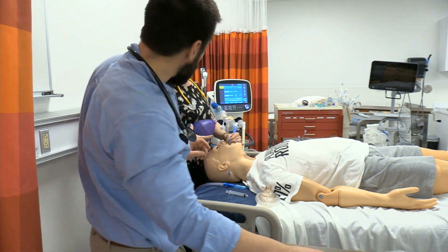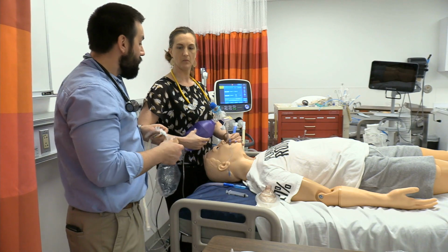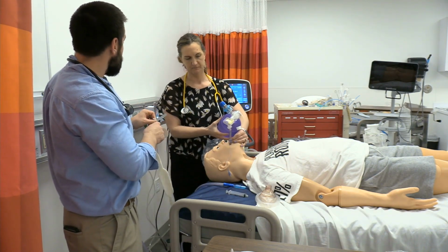So at this point, we're going to go ahead and secure the tube. A nice doctor. I don't know what kind of mood she's in here today, but can you help me out and kind of hang on to the tube? Sure. You don't got anything to do? You can stay away from the conference?